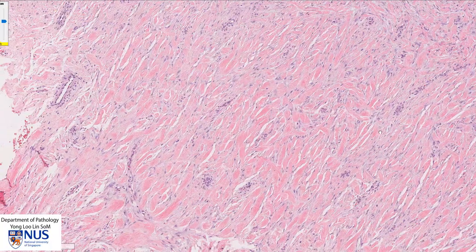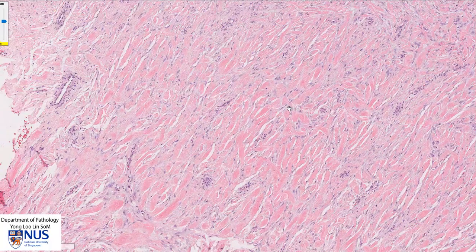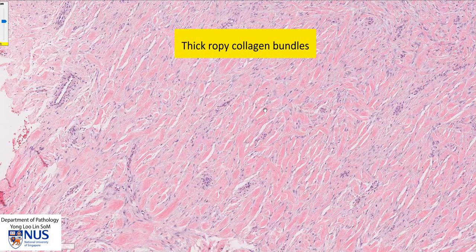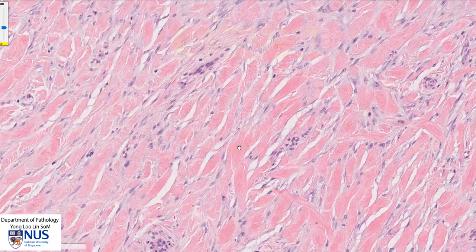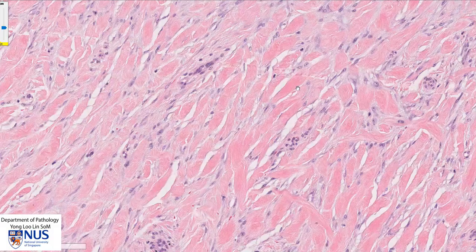In many areas, there are these pink, thick, ropey collagen bundles on high magnification. They almost have a glassy or hyaline look, and this is very characteristic of keloid. These collagen bundles are laid down by fibroblasts.